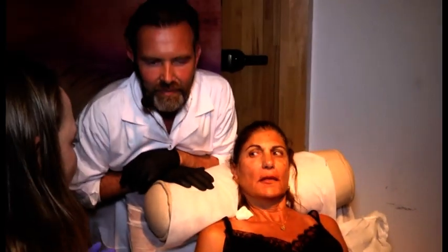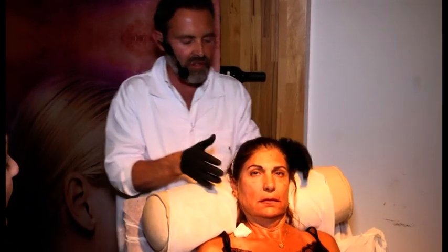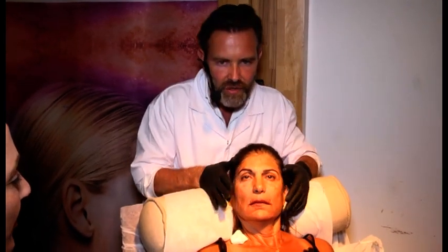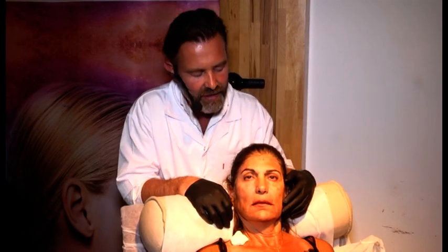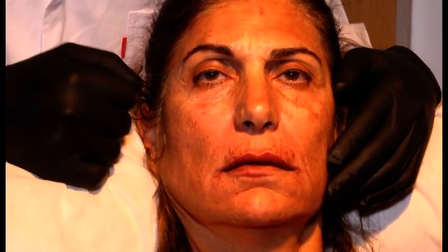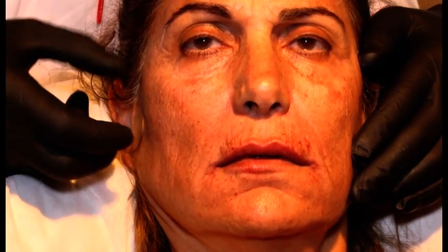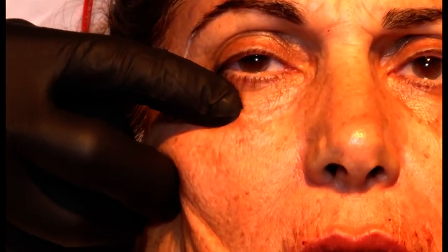Now, the last thing I will do today, and that is something that we have to be able to treat if we do a cheek augmentation, because if you look closely, you see that we actually have created a problem by giving her a nice cheek. The problem is a deepened palpebromalar groove, because the more that you inject in the cheek, the deeper this may become.